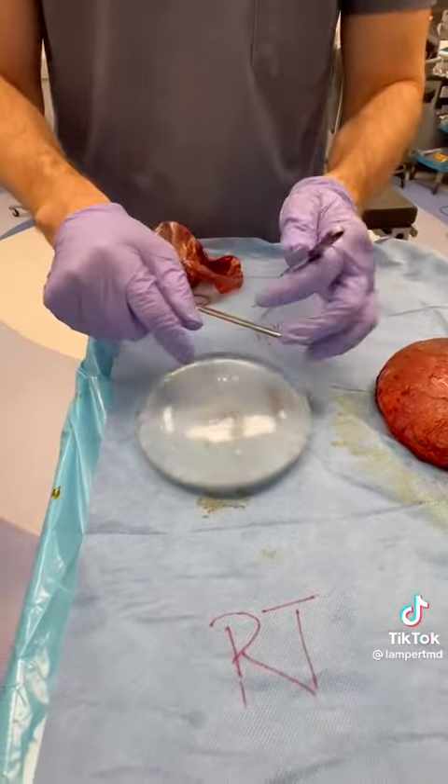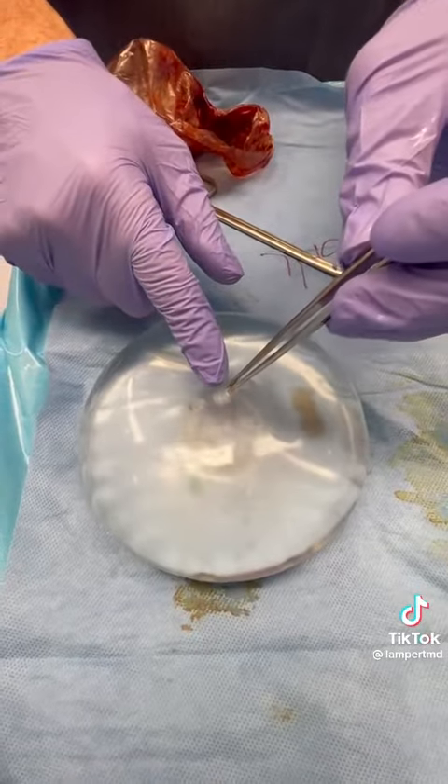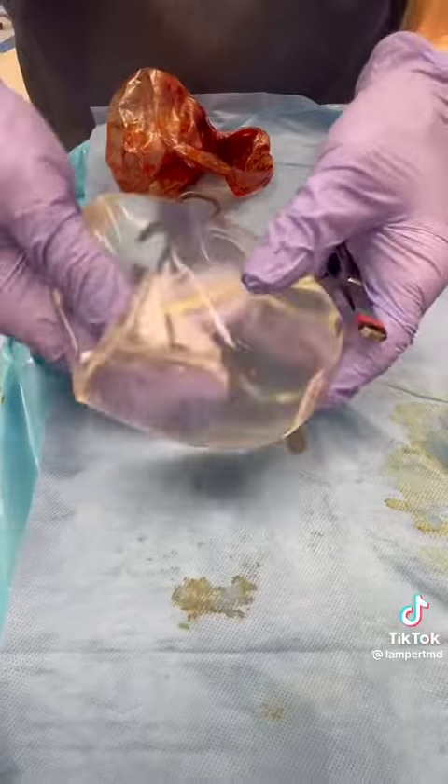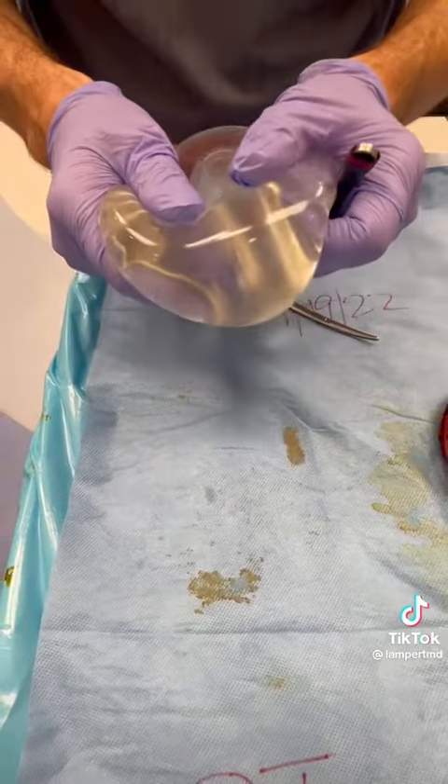It's a saline implant. It has a valve, so that's how you can see — that's how you fill the implant. She wants every implant back, so I'm not going to destroy it. And it says here 450.